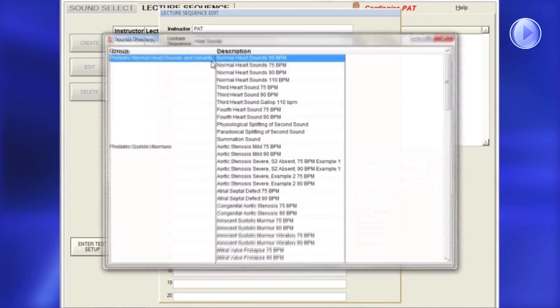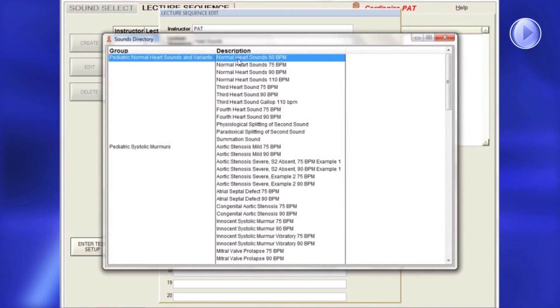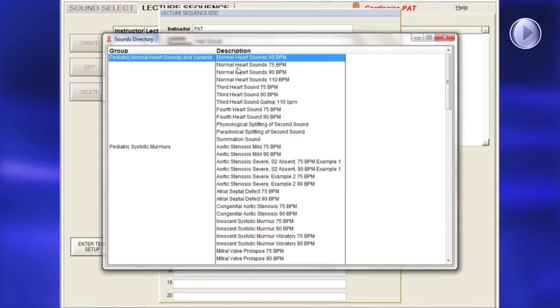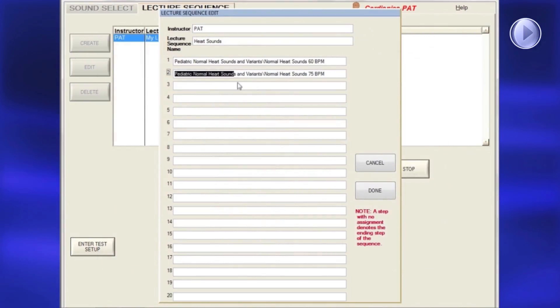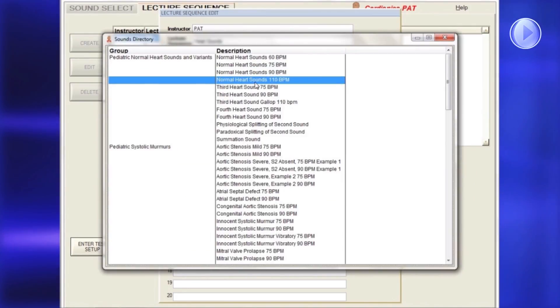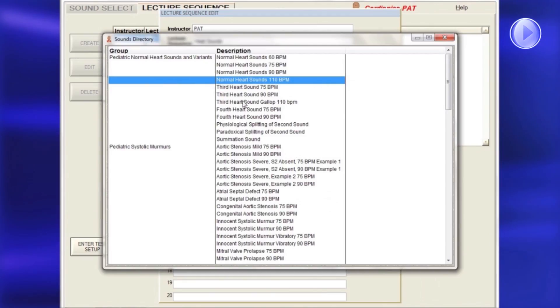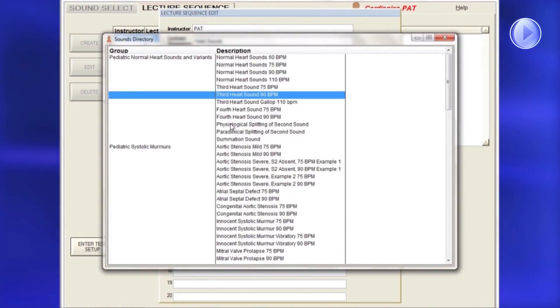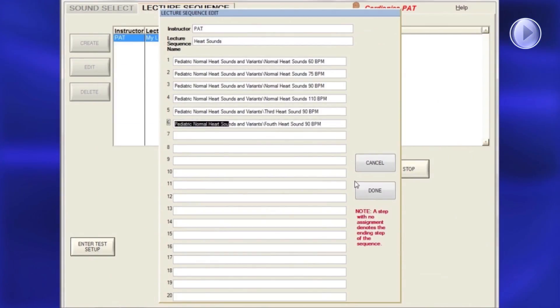Enter the instructor's name, then the scenario or lecture name. Next, double-click on a sound number to open the sounds menu. Double-click on a sound title and wait a moment for the sound to fill in the selected sequence. When finished selecting sounds, click Done.